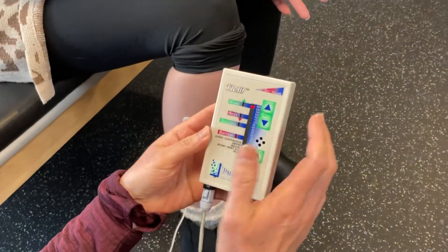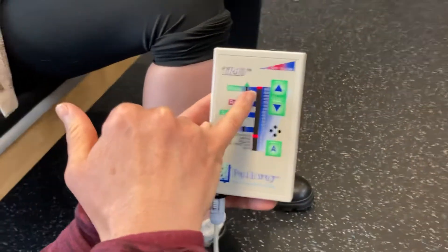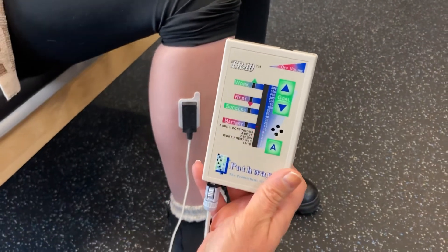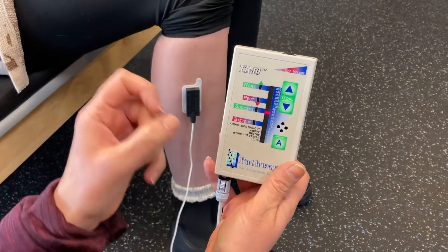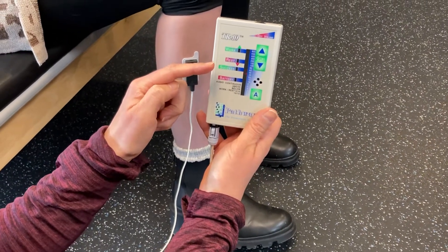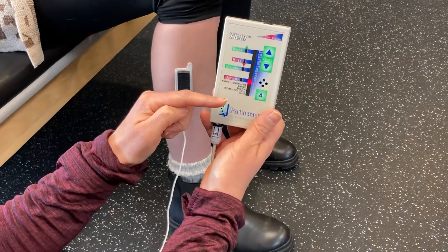We can see on the biofeedback here we have a red bar, and as she activates that muscle — go ahead and lift that — the red bar is coming up, showing more muscle energy as she comes up, and then she's going to relax down and it's going to lower down.